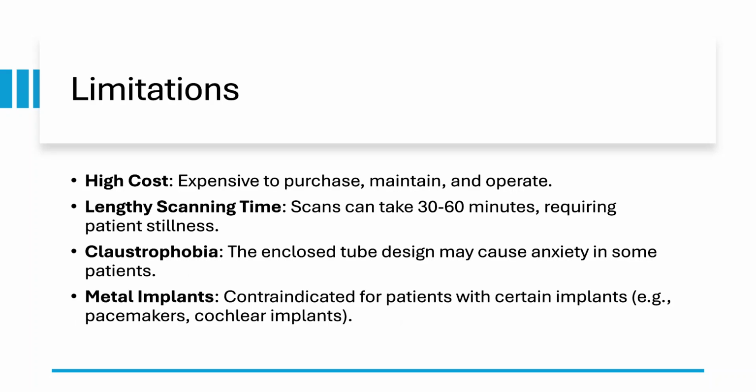Now, here are some of the limitations. First is high cost. It is expensive to purchase, maintain, and operate. Number two, it has lengthy scanning time. Scan time may range from 30 to 60 minutes and requires the stillness of the patient. Number three, people who suffer from claustrophobia may have anxiety. Number four, patient with metallic implants. It is contraindicated for patient with implants such as pacemakers.